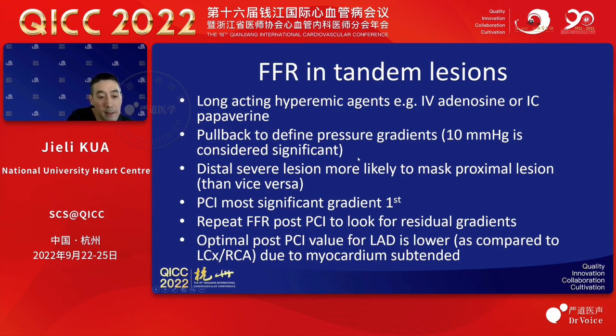So when you do a pullback, always fix the lesion with the more significant gradient first. And it's always important to repeat your FFR post-PCI to look for any residual gradients, because this is important to know if you have left anything behind and whether any lesions need to be further treated.